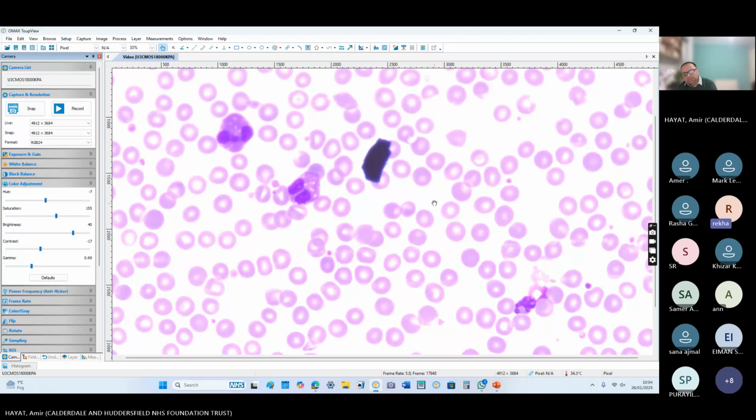Oh, okay. So the blood film is suggesting increased eosinophilia. I will request the GP to take a detailed history and examination, with a stool for ova and cyst, and CRP to look for infections, to rule out the secondary causes. GP knows about that. Give him hematological advice.